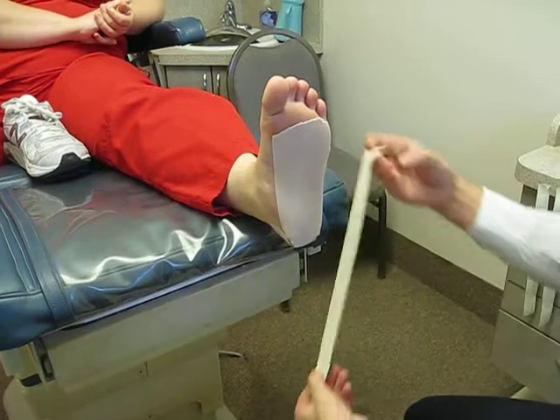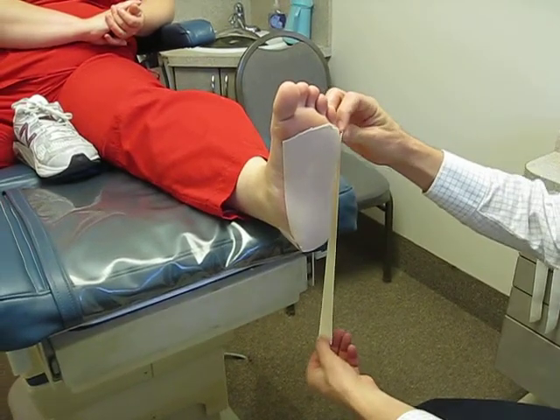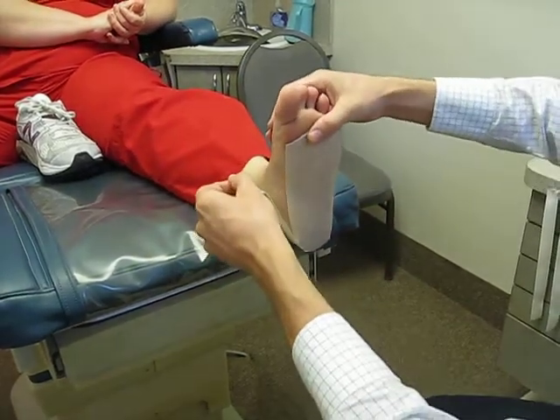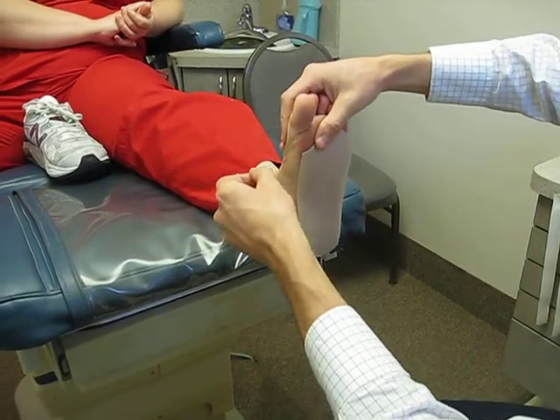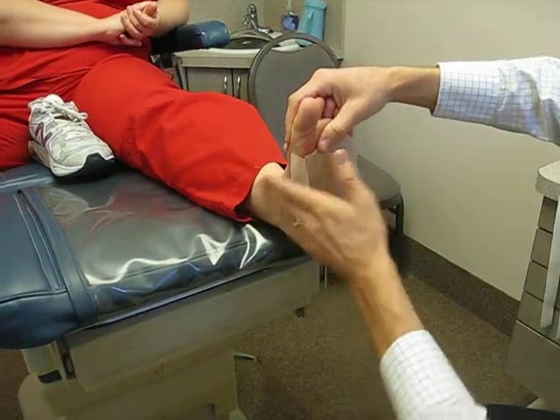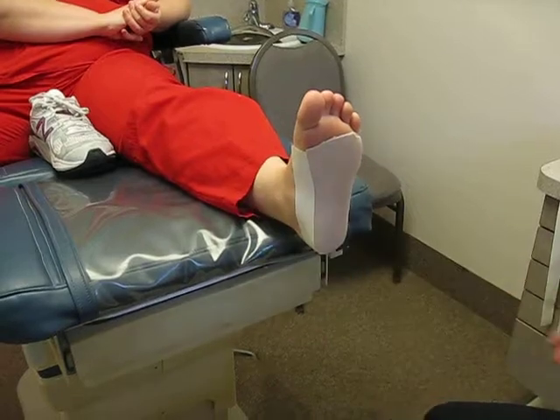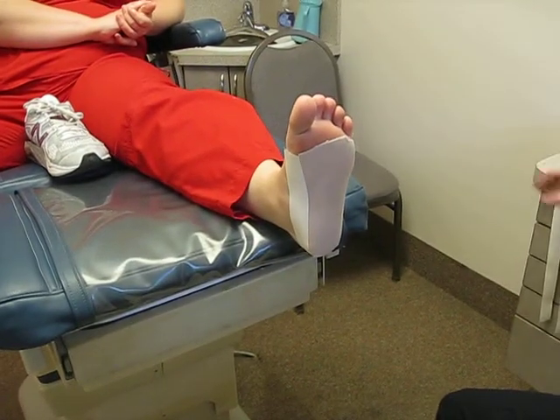You want to start by placing the tape by the 5th toe on the side, lay it down nice and smooth, and then as you come around to the other side, pull the big toe down so you increase the arch height and lay it on. You have to fiddle with this a few times to make sure the arch isn't too high, as sometimes that gets quite uncomfortable.